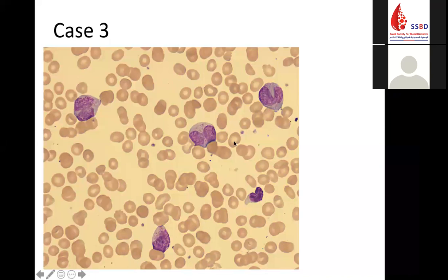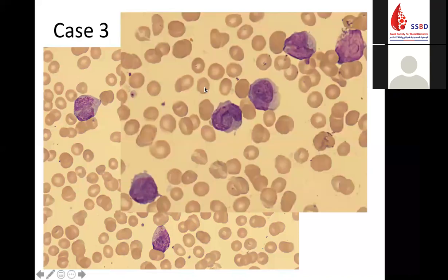And I think Dr. Haytham yesterday explained this very nicely. So we have a uniform bilobed butterfly abnormal morphology, and we have these fine granulations in the cytoplasm, which is going with the hypo or microgranular variant of M3. And also, you can notice that we have also a cupping here, or thumbprint, or drop of water over the nucleus.